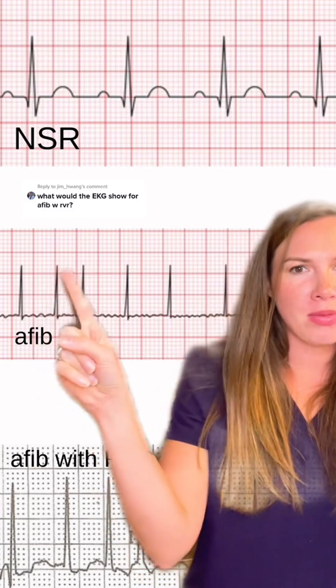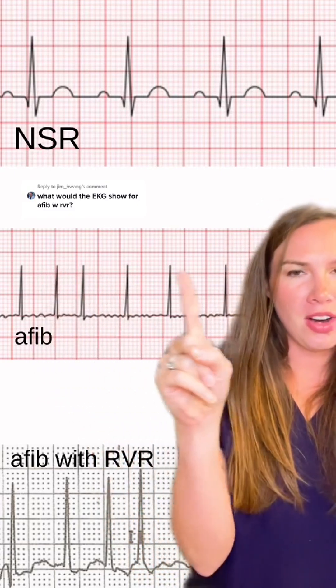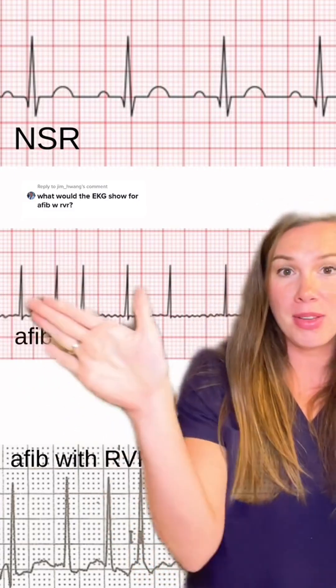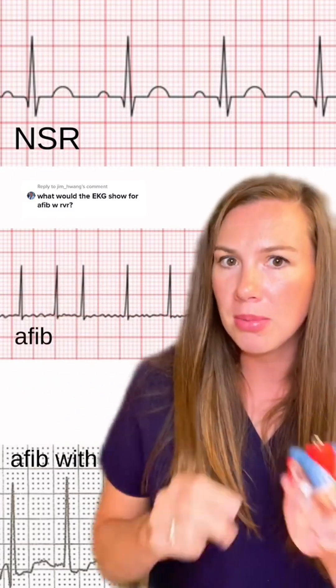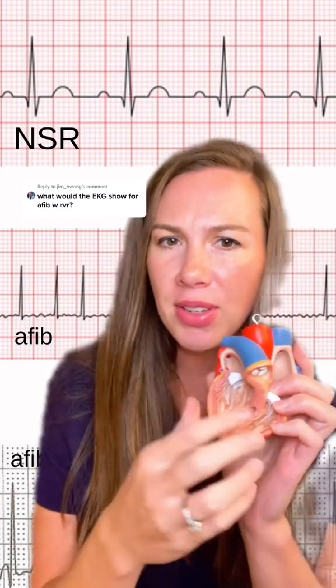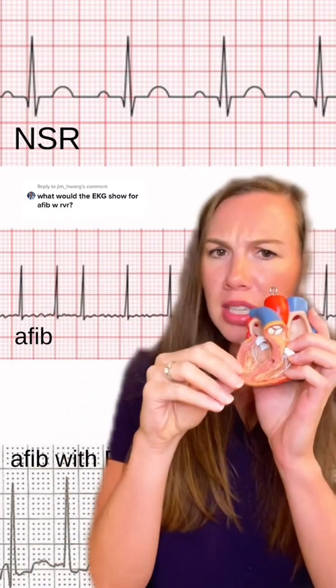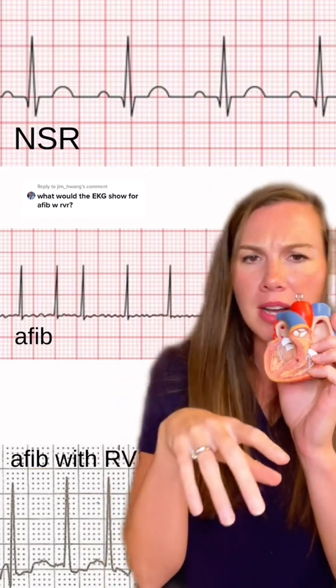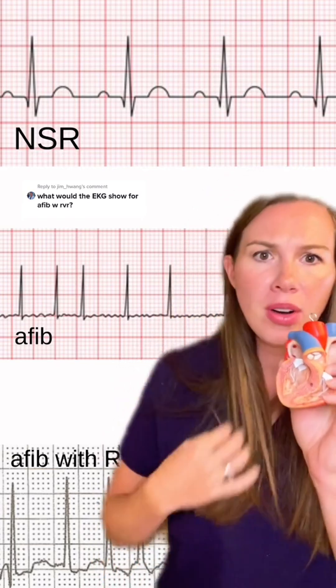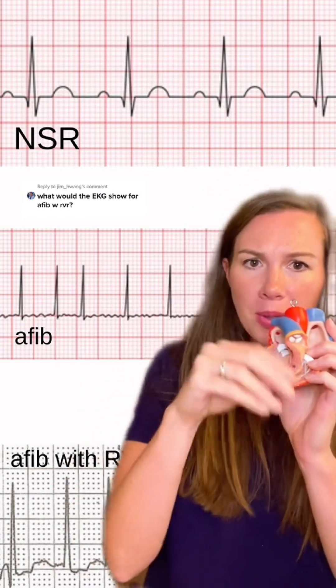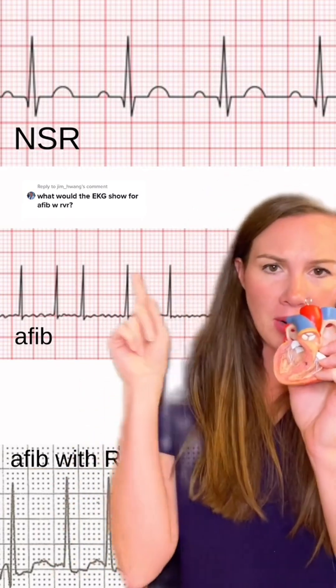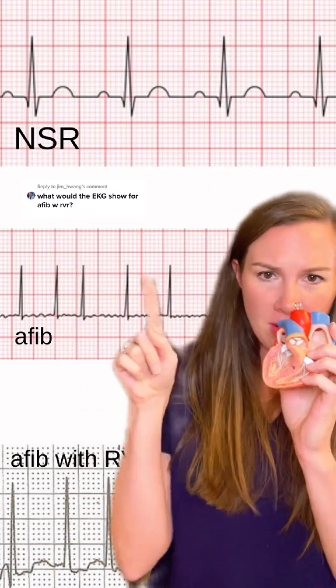We notice we don't have a regular R-to-R interval. AFib is always an irregular rhythm because the AV node is just letting some of those QRS impulses through — just some of those.